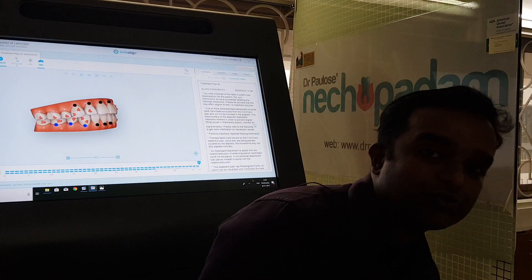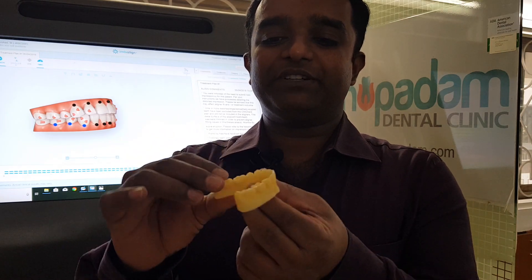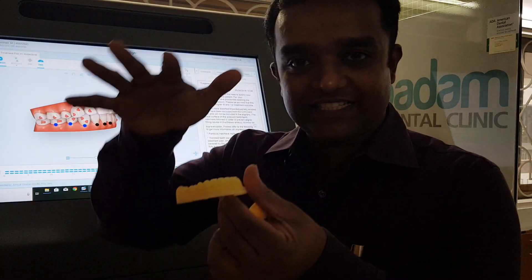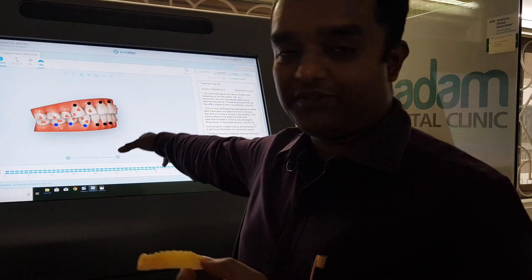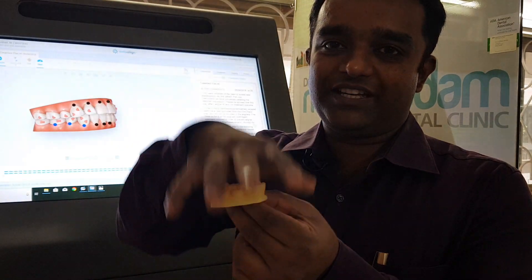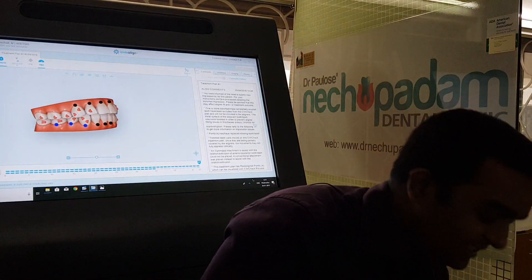Each step is 3D printed into a physical model. This 3D printed model is used to fabricate the aligner trays — a plastic sheet is heated, pressed onto the model, and sucked down using a vacuum. That is how we get the plastic trays that you wear every 15 days.